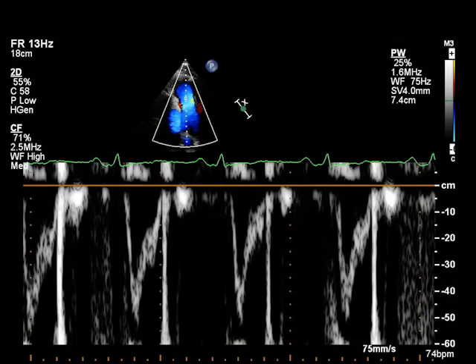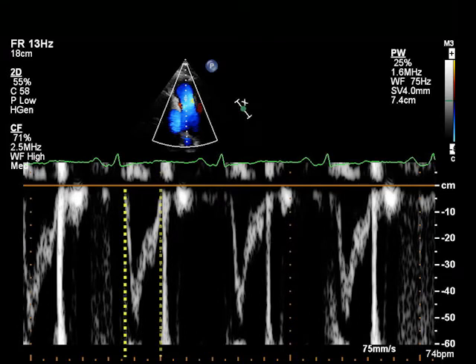In this parasternal short axis view of the right ventricular outflow tract, the ejection time, or ET, is measured from the onset to the cessation of the flow as shown.